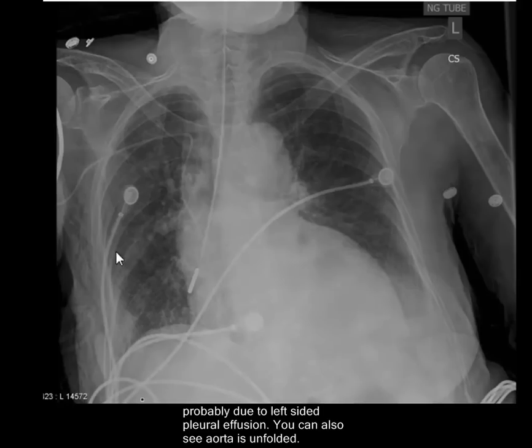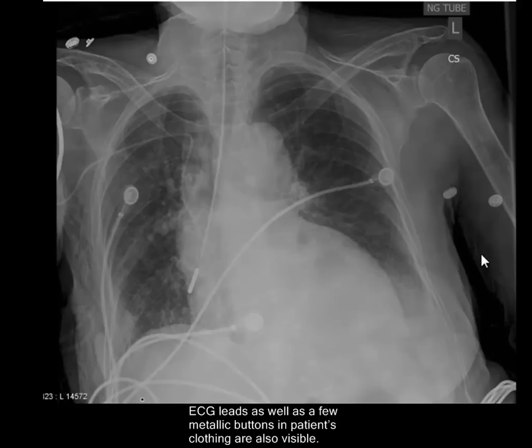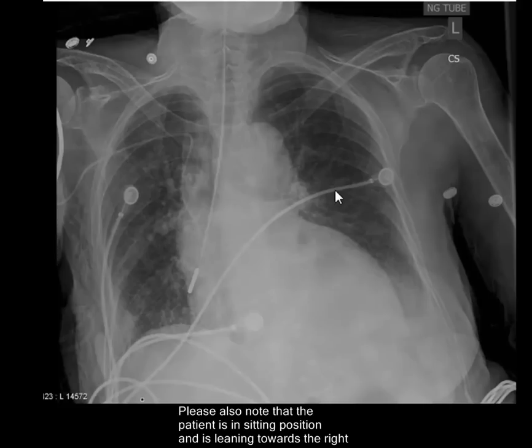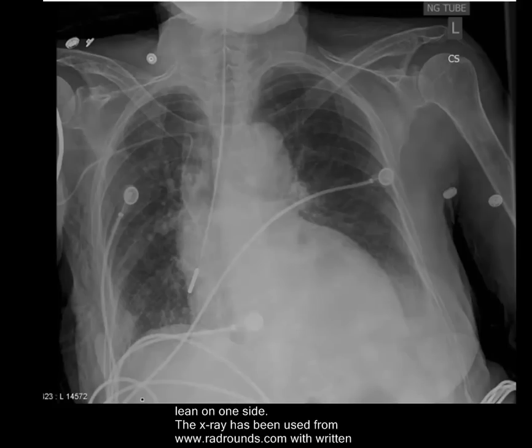Several ECG leads are visible, and several metallic buttons are present in the patient's clothing. Please note that the patient is in a sitting position and is leaning towards the right hand side. Patients with significant strokes cannot sit straight as one side is weak — they tend to lean to one side or the other.